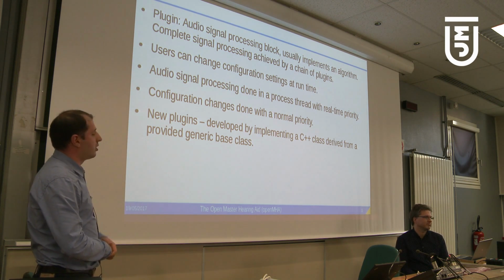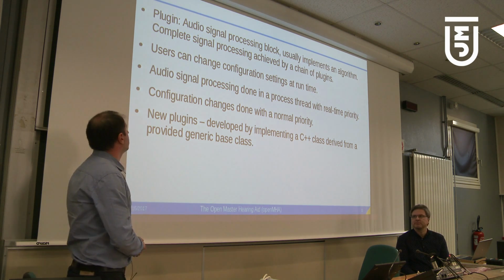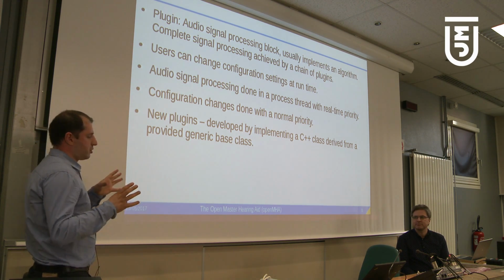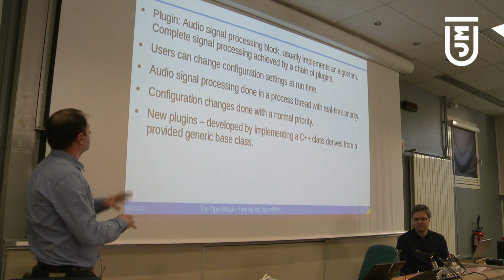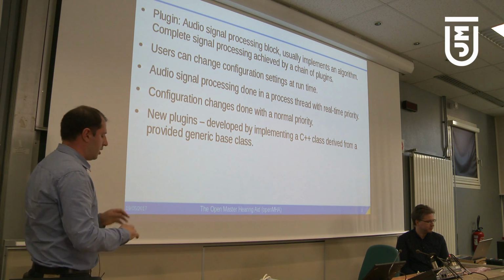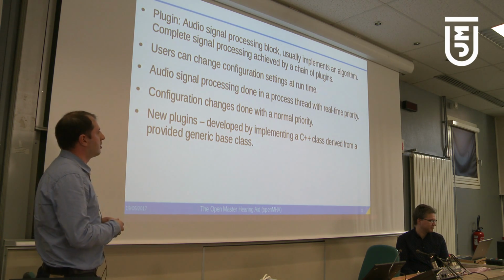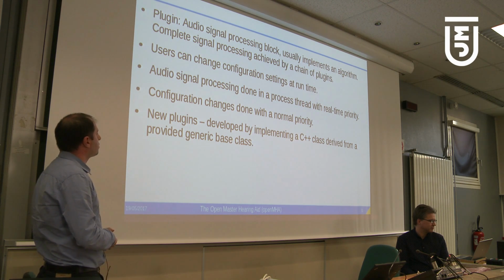What's important for both research and medical trials and so on is that users can change configuration settings at runtime, and in order not to disrupt the real-time signal processing, this problem is solved in a certain way in MHA, where the signal processing thread has a real-time priority, whereas the configuration change usually doesn't.